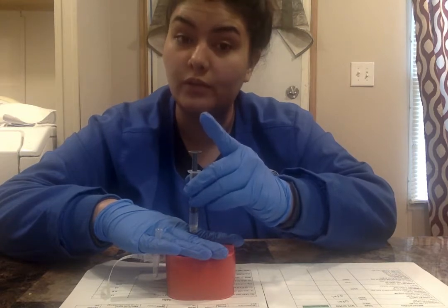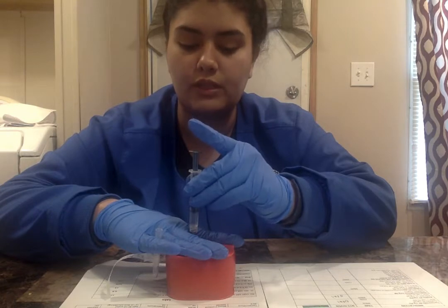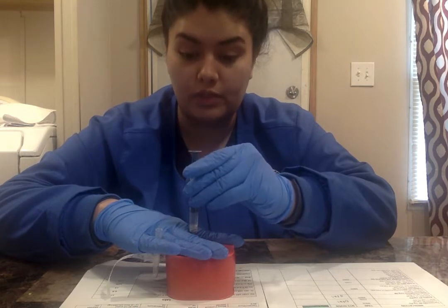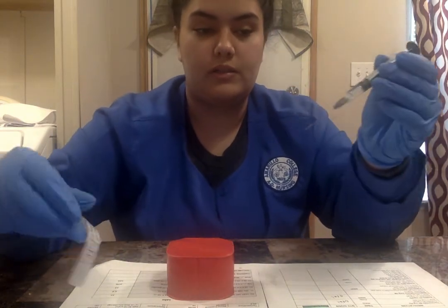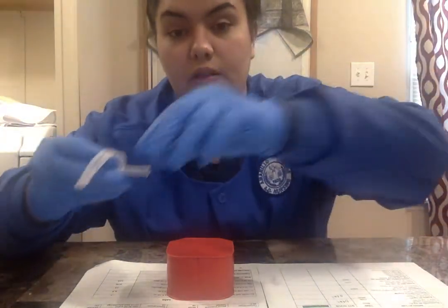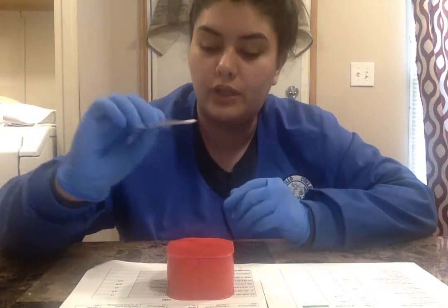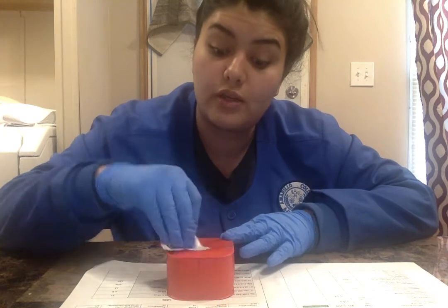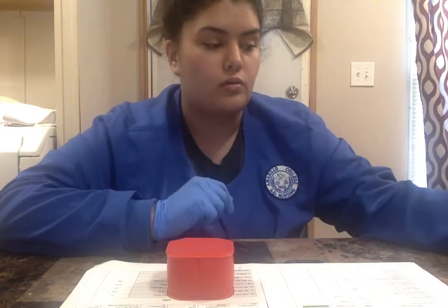Always make sure to aspirate with intramuscular injections. Since there's no blood, I'm going to inject my medication. Okay, that is going into the sharps, and this goes in the sharps too. Now I'm going to massage this medication, because you can massage this medication, and throw away my alcohol swab.